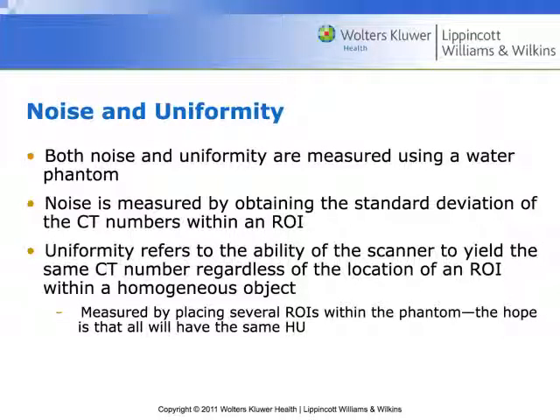Okay. So typically we are going to measure noise with just a water phantom, and it's water with some nickel or other kind of metals in it, so that it has some kind of value a little bit more than water. So if you ever drop and crack a QA phantom, I don't recommend that because they cost tens of thousands of dollars, but I also would not recommend drinking the water that's inside of them. So the noise is going to be measured by the standard deviation between the CT numbers in the ROI.